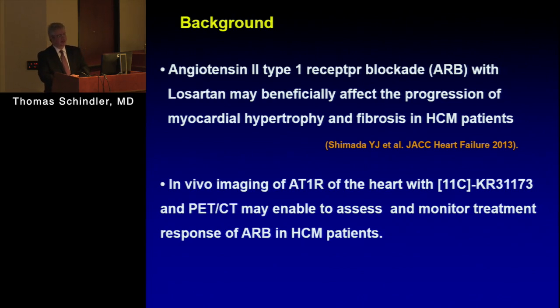On the other hand, you have information that angiotensin may cause continuous hypertrophy and progression of fibrosis, so you would like to treat patients. And so that's why it makes it interesting for imaging, because if you find a modality to show, okay, this patient has really high expression of AT1 receptors, maybe it's worth trying ARB inhibition in these patients. Low dose, you may then increase it to the tolerated dose.